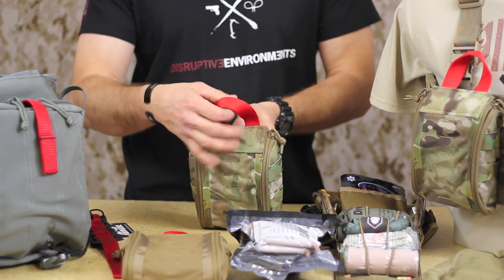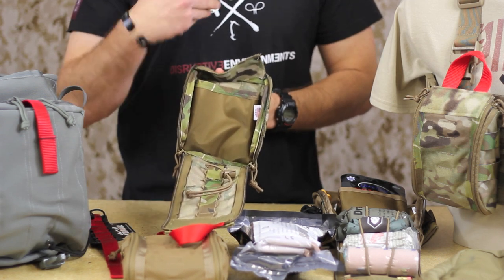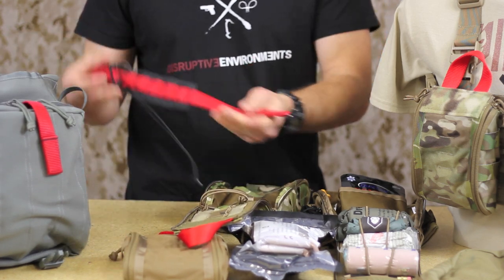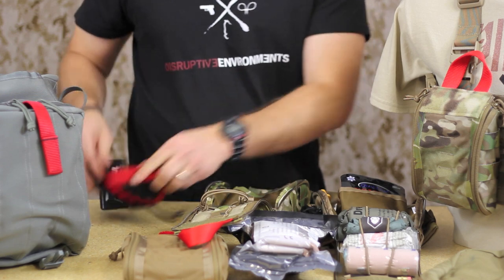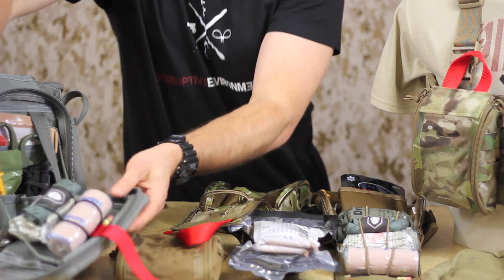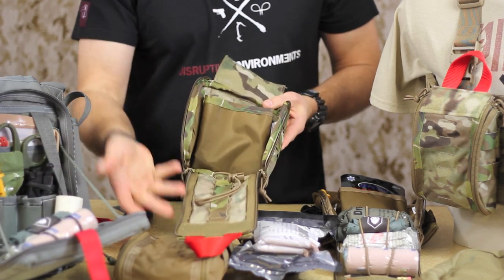So basically with this big red pull handle, we're able to create a pouch that just rips down. That design is kind of taken from what we had designed with Zulu already, which is the med insert that attaches to our discrete messenger bag, so that you can pull that pocket down for immediate access to those components as well. We wanted to take that concept and apply it into a pouch.